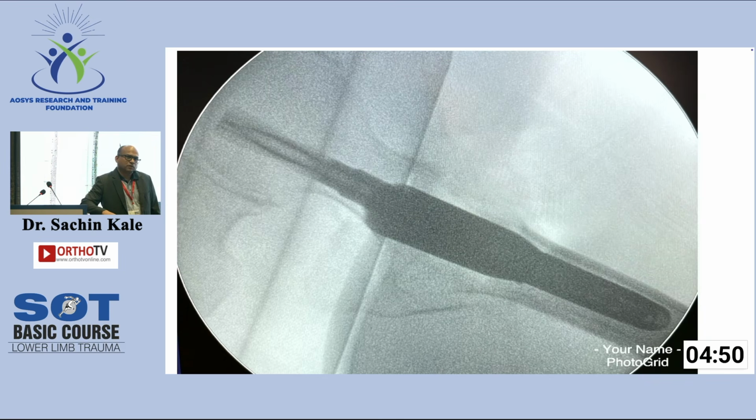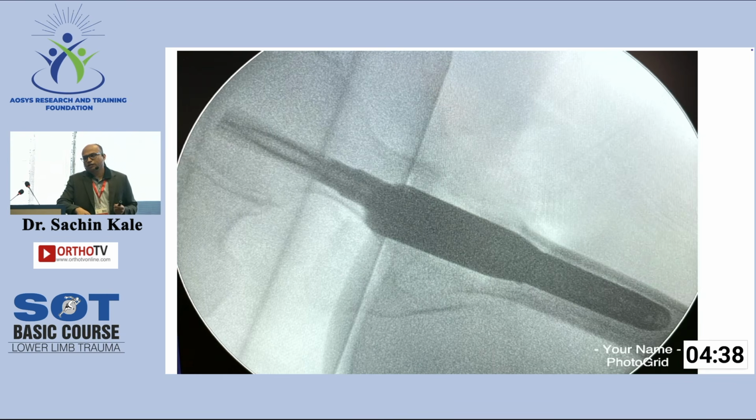Predominantly, I feel both have little, not a major issue, but with a screw, 1 screw or 2 screws, that also is a big thing. But if the lateral wall integrity is not there, I'll prefer 2 screws. And helical blade, I don't know. Still, I think reduction again. I prefer a helical blade rather than a screw.